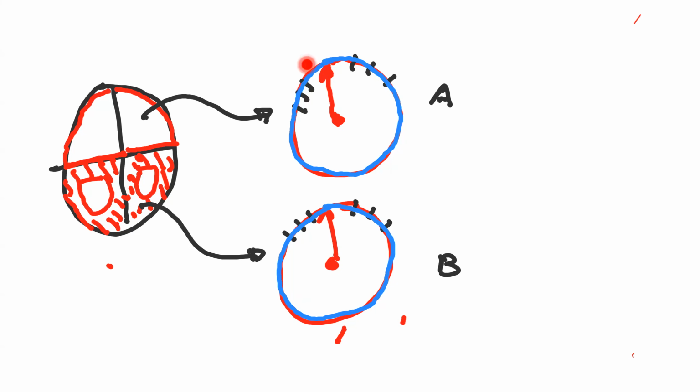Yes, speed කියලා කියන්නේ අපි කිව්වා slow. ඇයි අපි කිව්වේ atrium වල කොහොමද cells ගන්න බලන්න කලින් පින්තූරේ atrial වල මොකද කිව්වේ අඩුයි. අර cells ගාන අඩුයි. ඒ වගේ මොකද මං කිව්වේ A සිට B දක්වා ගමන් කරනකොට time එක මොකද උනේ, check the previous, ටයිම් එක වැඩි. time එක වැඩි වෙනවා කියලා කියන්නේ මෙතන ඉඳන් මෙතෙන්ට ගත වන කාලය වැඩි, ඒ කියන්නේ needle එකේ speed එක slow.